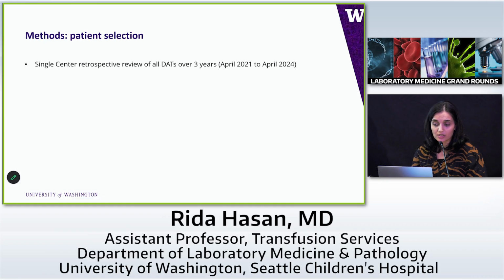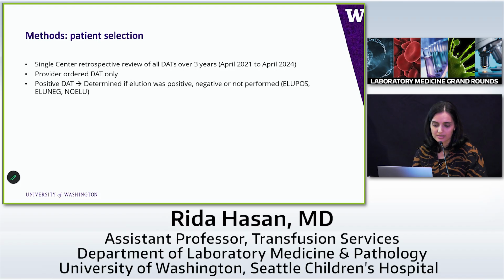So for my study, I did a retrospective review. We looked at over 3 years of DATs that were sent out. We only looked at provider-ordered DATs. For people that rotated through the blood bank, we do DATs as reflex testing all the time when we do an antibody screen, or on cord blood samples and all these other situations. But I only looked at provider-ordered ones because the thought would be they'd only order if they were concerned for hemolysis. And if it was a positive DAT, then I determined whether the elution was positive, negative, or not performed.